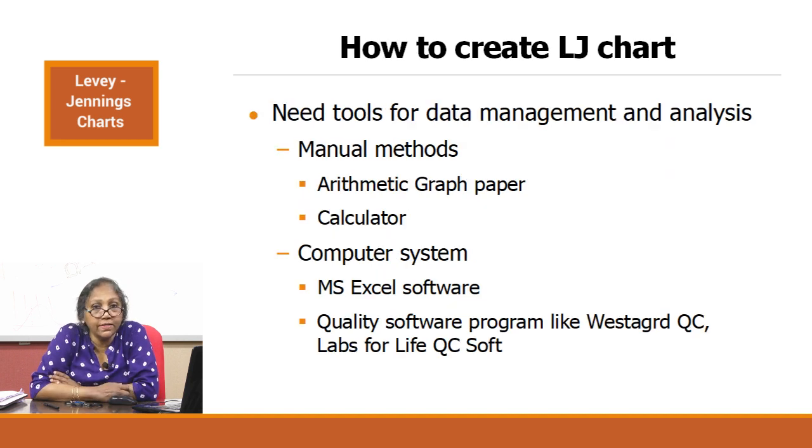And how to create an LJ chart depends, again, on how we are going to do it. Do you have a computerized system available? Do you have a built-in QC module, in which case you don't need to create an LJ chart outside? The caveats I have already described. Look at your module and see whether the QC module in your built-in system is allowing for 3 SDs. And if not, would you want to create your LJ charts outside of the system? So you make these decisions initially, and then you decide how you are going to do it.